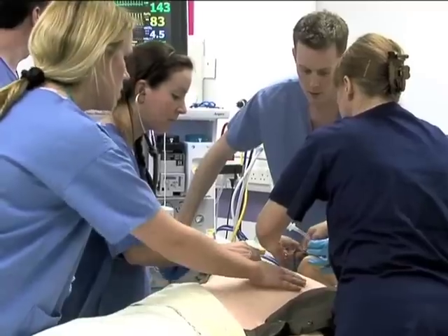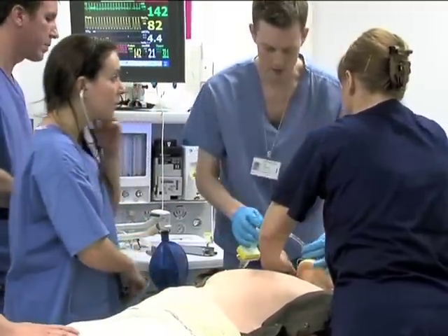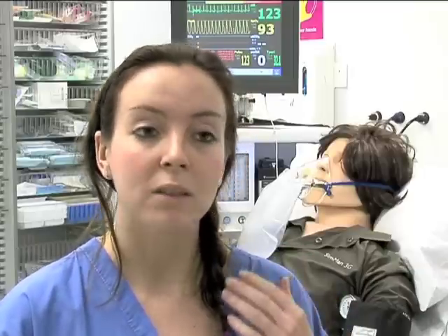It's not something that I would listen to regularly, but you can hear the wheezing of the chest and you can hear the heartbeats, all of which give a good indication, I imagine, as to what it's like on a real patient.